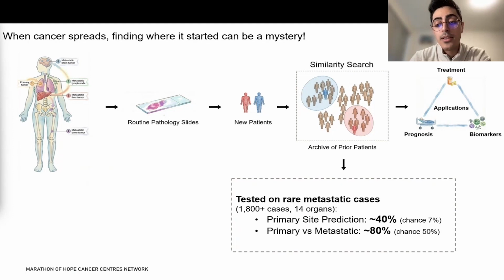So the model is completely unsupervised and can serve as a tool for pathologists and doctors in the hospital to narrow down the search space and the possibilities for each new patient in the clinic.